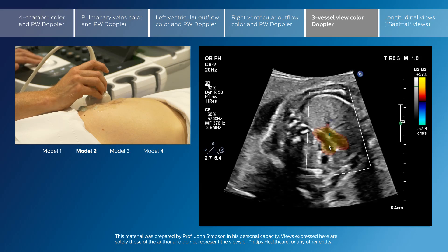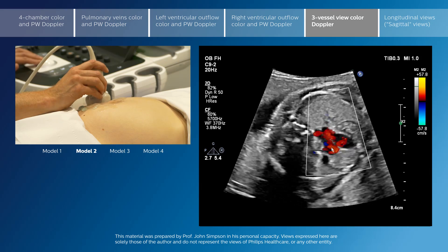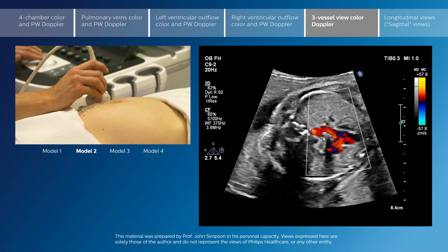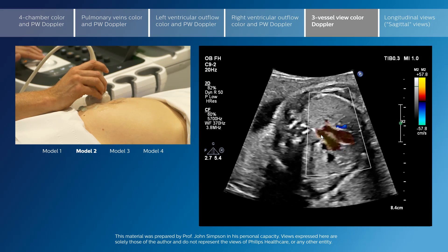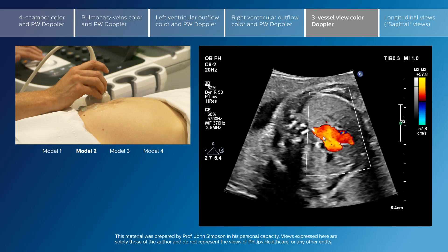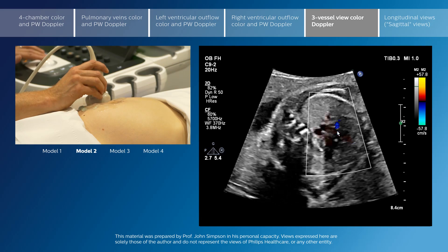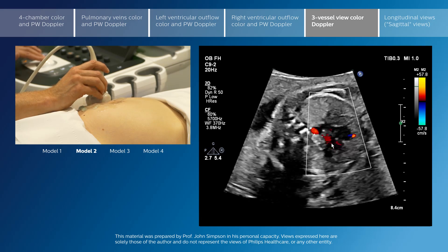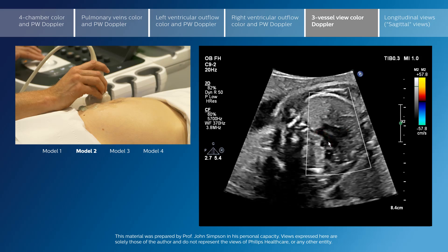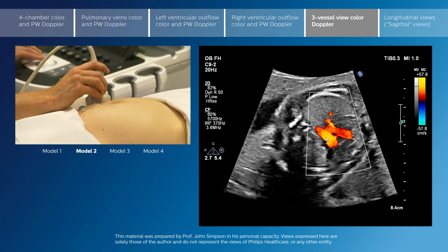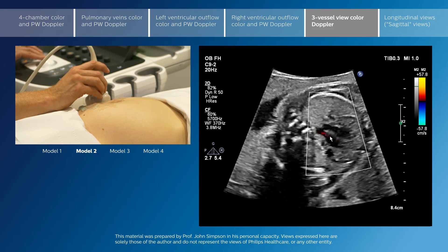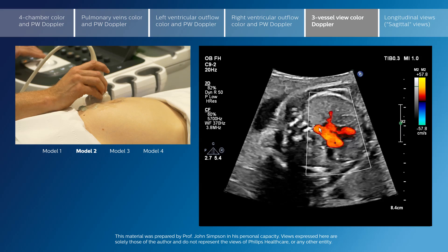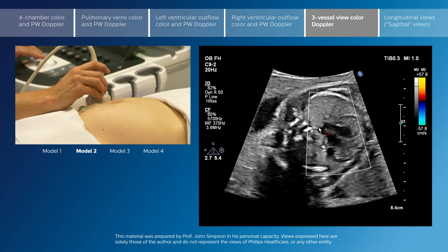Superiorly into the three-vessel view, we see red flow and antegrade flow in both the ductal arch and the transverse aortic arch. The flow is from the heart to the descending aorta in both vessels.